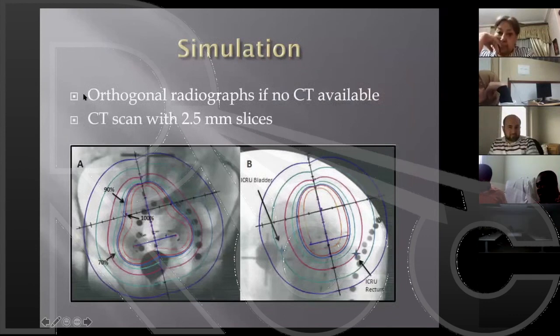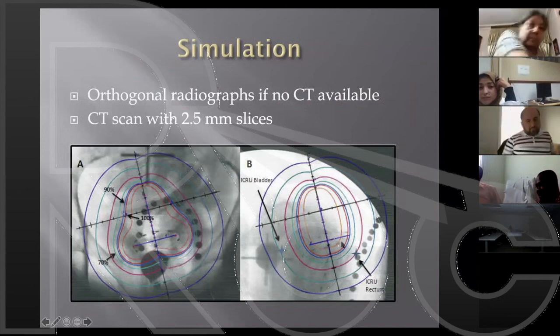These are images from a project that Adam and I and others did in Senegal, where we created isodose overlays that overlay on the tandem and cylinder applicators. And you can also create them for the tandem and ring applicators. You can create a library of plans, do orthogonal radiographs, scale up your overlays to the magnification of your radiographs, and determine if your ICRU rectal and bladder points are within tolerable doses.